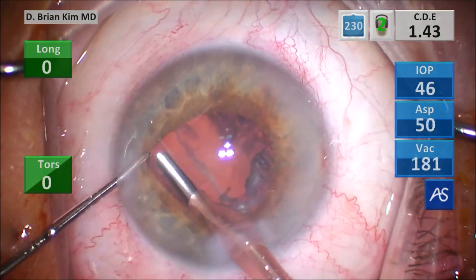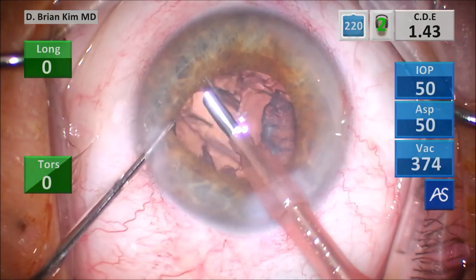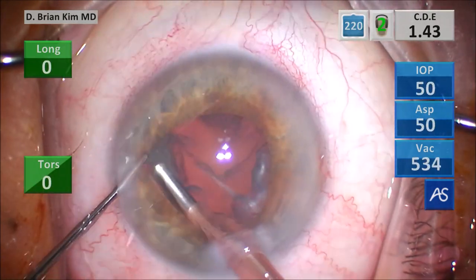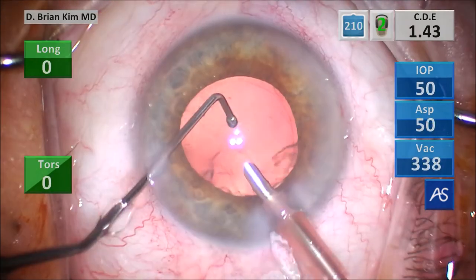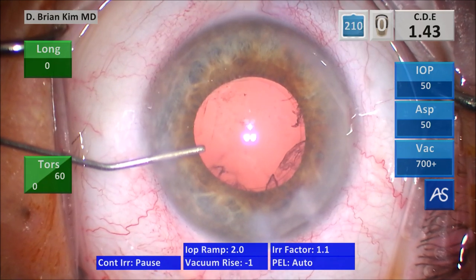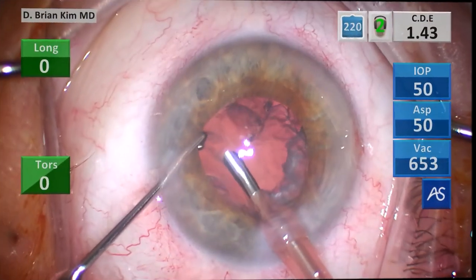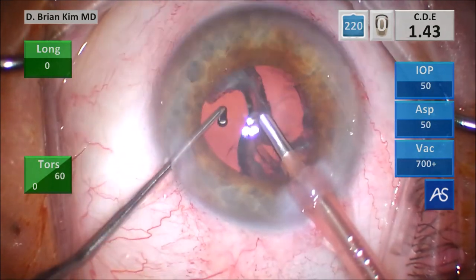I'm trying to get around the epinucleus, loosening it, retracting the pupil on the left side. I grab the epinucleus, lift it up, and start to remove it. But there is actually a tear in the posterior capsule. As you pay attention here, you should see it. I'm pushing BSS — where is the tear? It's right here. This is another reason why I push BSS at the end of every maneuver and I like to keep the chamber filled. As I was hooking the chopper to retract the iris and grabbed the epinucleus, it also broke the posterior capsule.